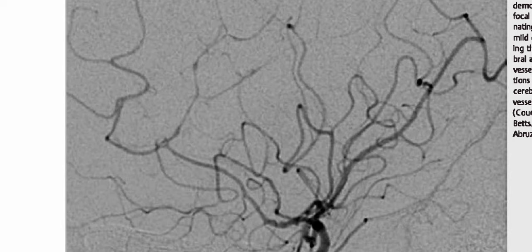So, considering the key imaging finding of multifocal regions of vascular stenosis, the top differential will be a reversible cerebral vasoconstriction syndrome, which is in this case secondary to the vasoactive drug use. However, you can add vasculitis in the differential along with vasospasm and atherosclerosis.